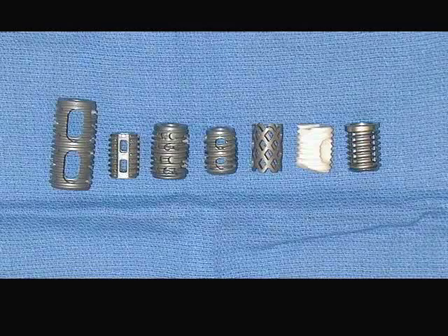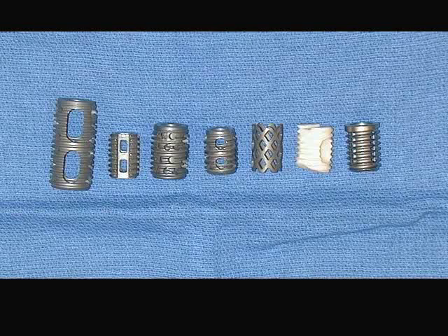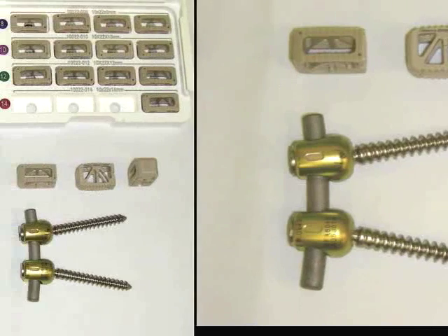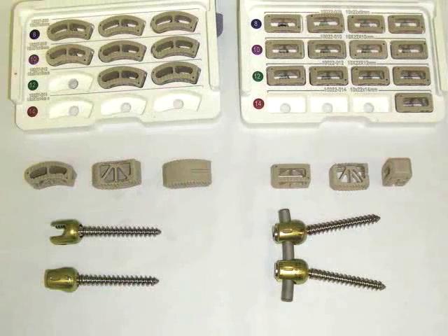These are some of the interbody fusion devices that have been used. Many of them have been titanium. There's one that's bone material in this image. All of these devices are placed within the disc space for the interbody fusion to occur. On the top row are examples of this plastic material that is filled with bone morphogenic protein. On the bottom picture are examples of pedicle screws and rods. This is an example of just the various sizes and shapes that are available for interbody fusion.